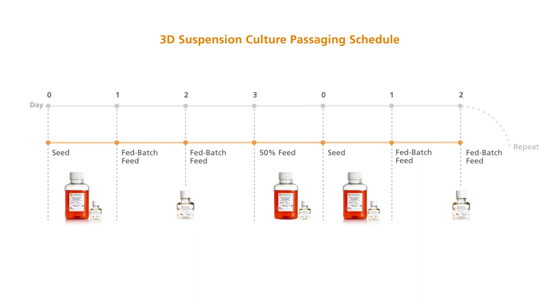For a 4-day passage, a 50% media change is done on day 3 to remove the lactate produced, to maximize cell growth over the last 24 hours.